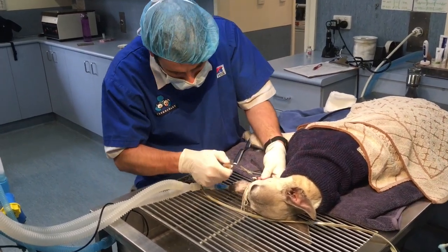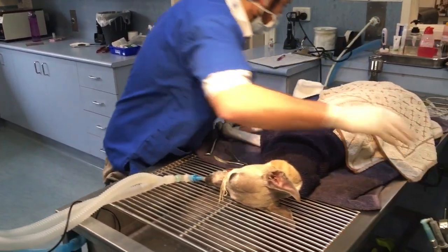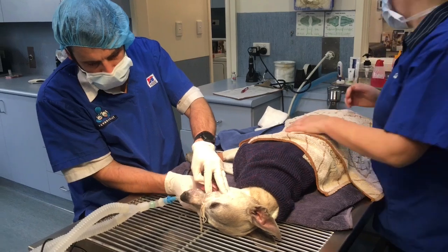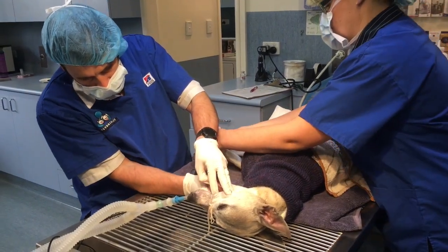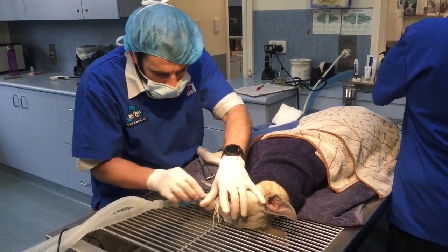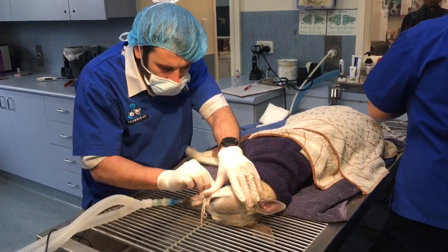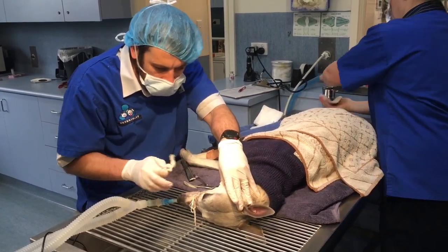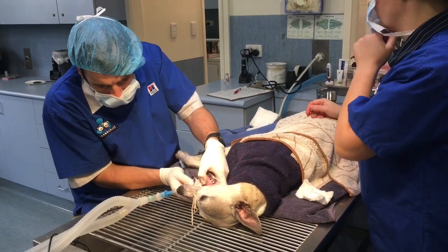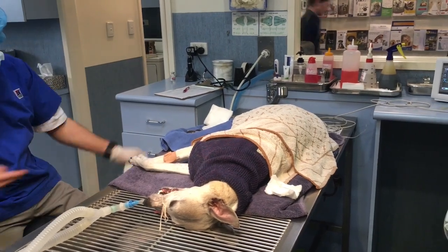Once we're done with the procedure, we turn the gas anaesthetic off. Because it's a volatile anaesthetic agent, basically what she does is she just breathes it out — she just blows it straight off. Once we turn it off, the concentration in her blood starts to drop. She's going to get lots of oxygen to help keep her blood nice and oxygenated. She'll slowly wake up. They sometimes vocalize a little bit when they wake up because they feel a bit disoriented. And that's it — that's how we do a dental.